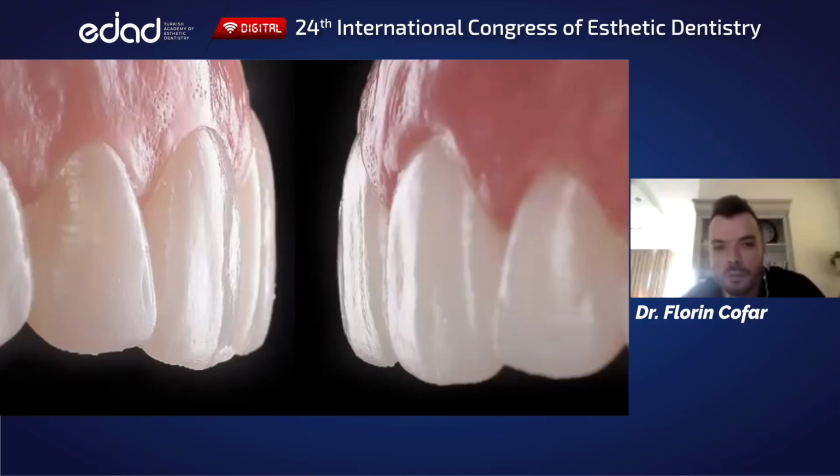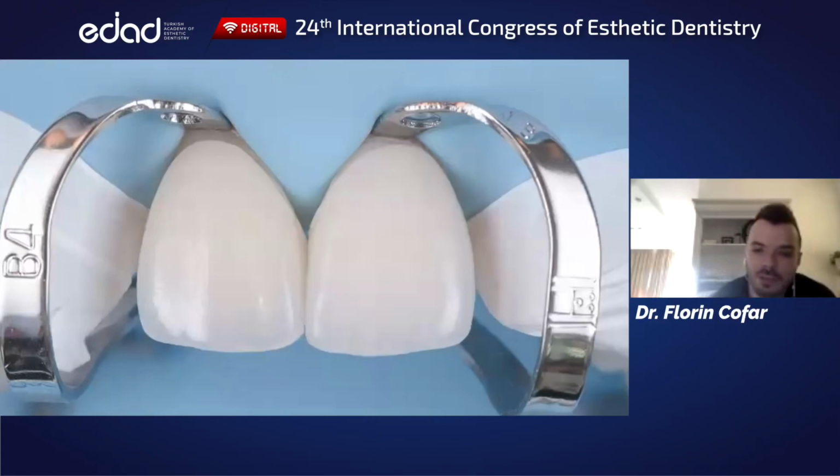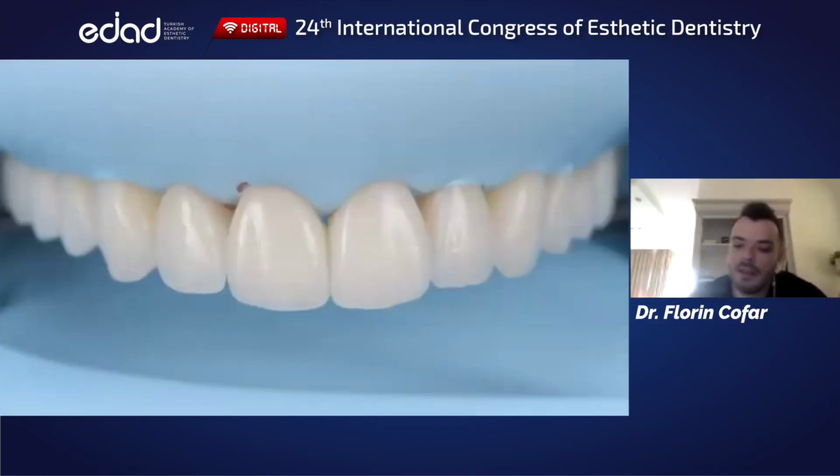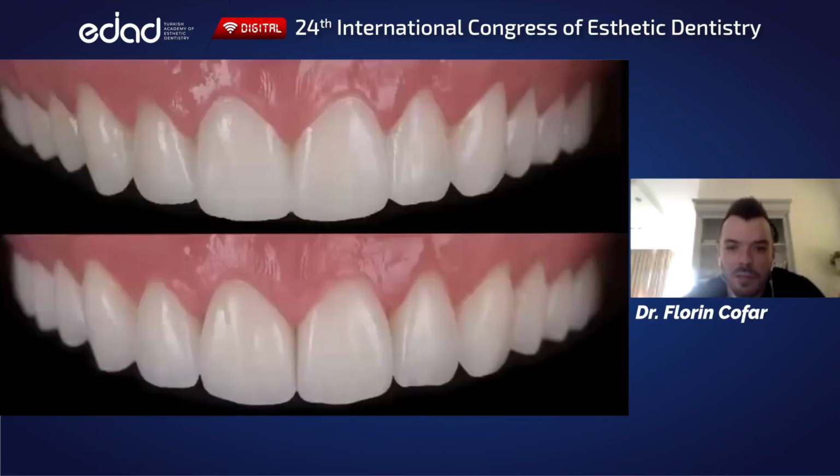You're going to use it first to communicate in a form of motivational mock-up, and then you're going to use it to actually do the prep, do the provision, everything else. And then when you go to the ceramic part, you're going to copy the same library in ceramic, mill it in monolithic material, simply stain it, and then you're going to bond it, and this is the end result. And you can see again the copying ability that we have nowadays with technology and with this way of working.